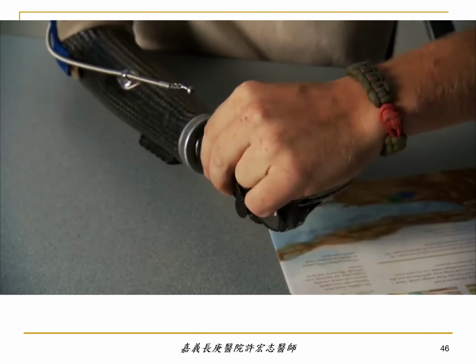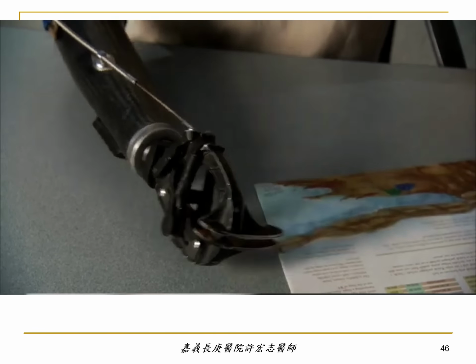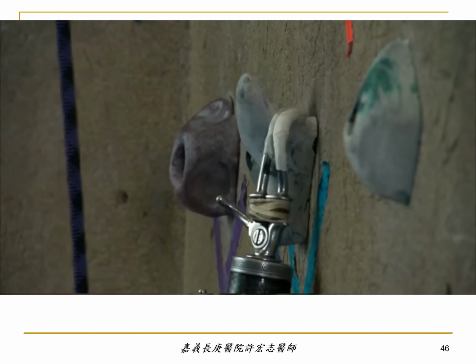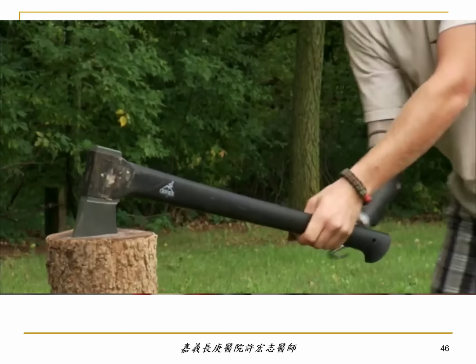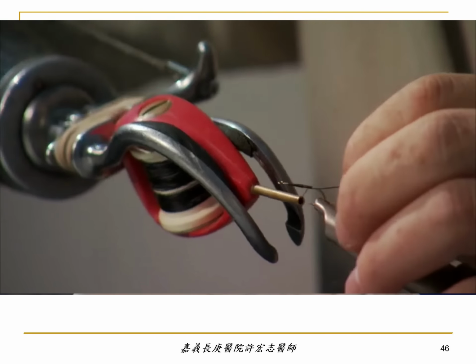The nice thing about the one that I use every day is that it has a large surface area for gripping, and I can also adjust how tight it grips. The hook is like my workhorse. It's rugged and it's simple. It works great for whether I'm fishing or hunting, splitting wood, or if I'm just tinkering with really small tasks.